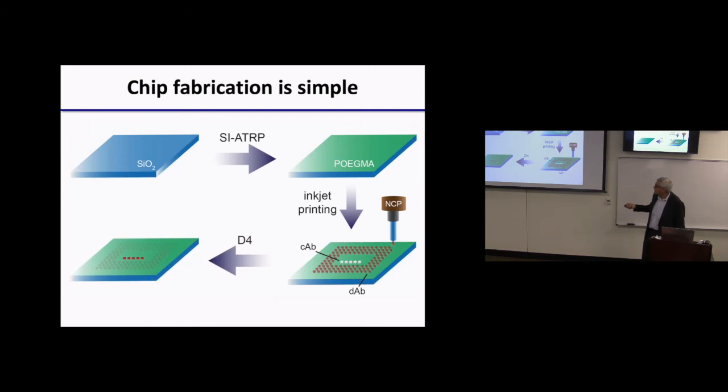And the idea is that when the assay is completed, these should dissolve, the intensity of detection antibody should go down, and then you should see bright spots emerge in the central region if you completed the assay. That was a first generation assay where we actually mixed the excipient with the detection antibody and printed these spots.